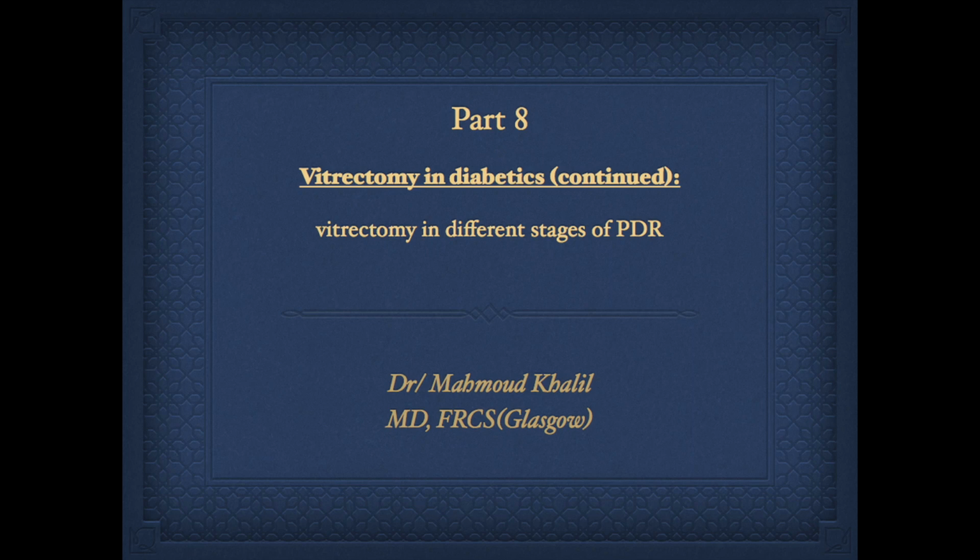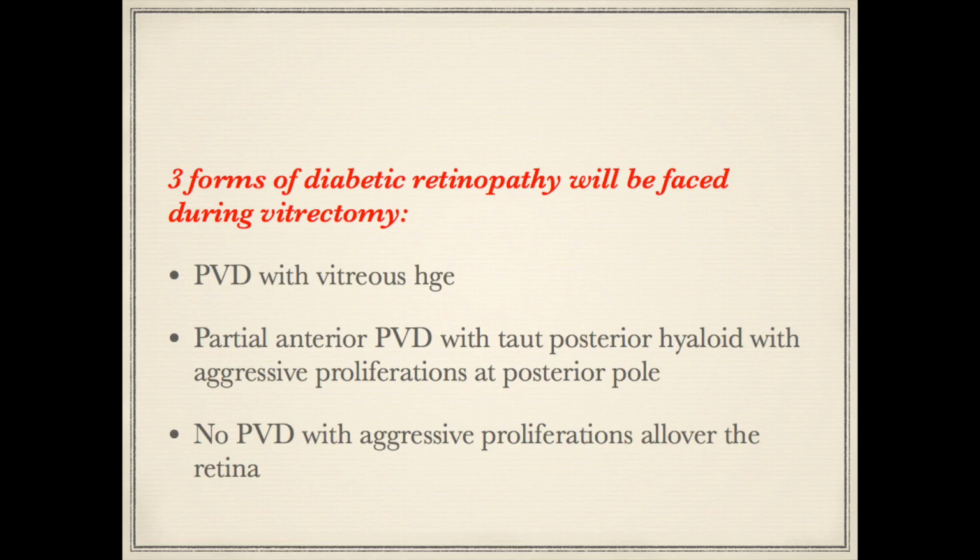This is part 8 of step-by-step vitrectomy. Continuation of vitrectomy in diabetics. Vitrectomy in different stages of PDR. Three forms of diabetic retinopathy will be faced during vitrectomy.